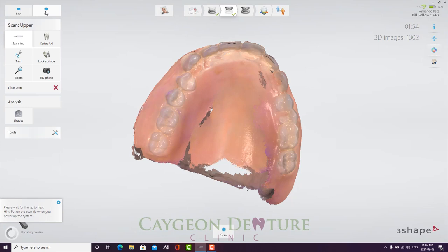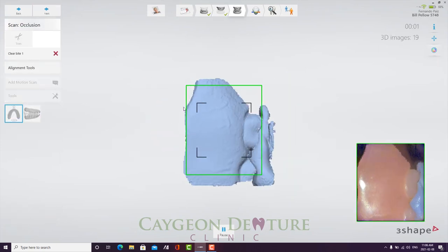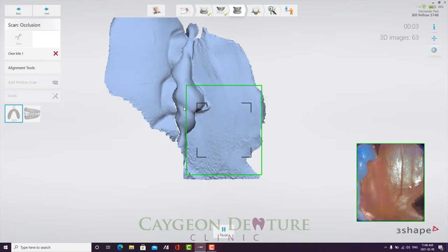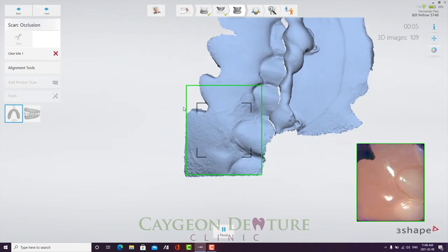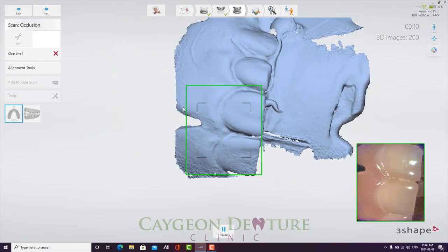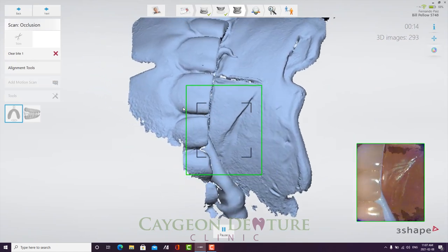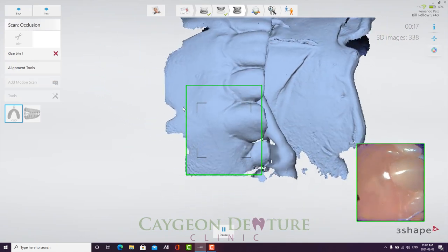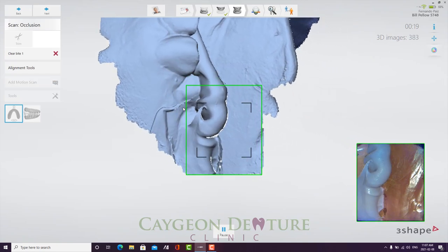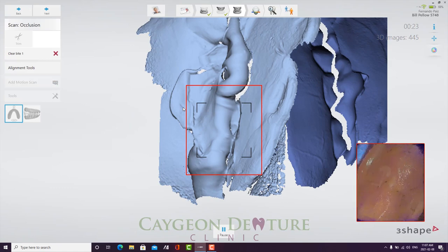Next is the meat and potatoes of the scanning workflow, and that is to go ahead and scan the bite. So in this case, what I did was I checked VDR and VDO in the mouth. Then I used bite registration material to put the upper complete denture in tight occlusion against the lower bite rim, and therefore I was able to scan the bite that way.